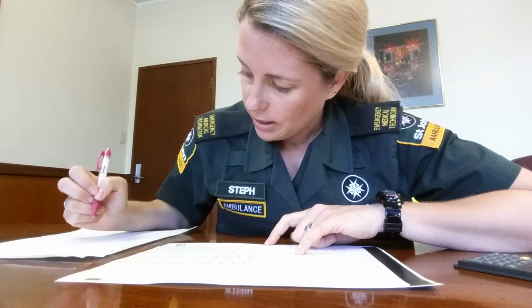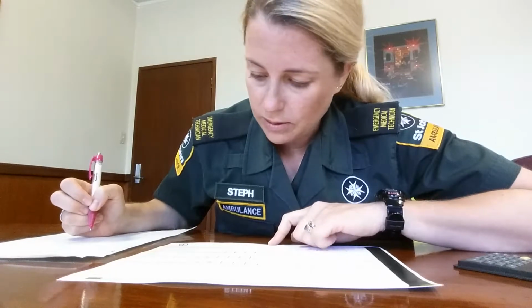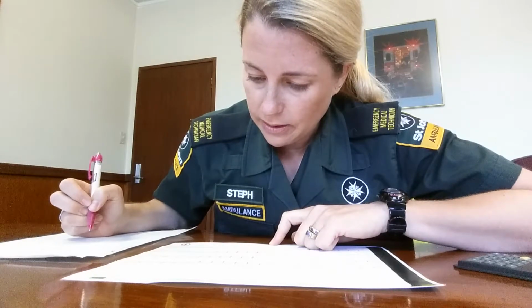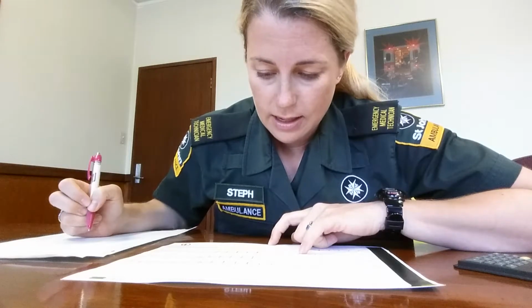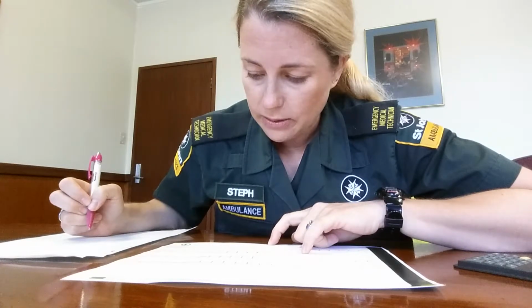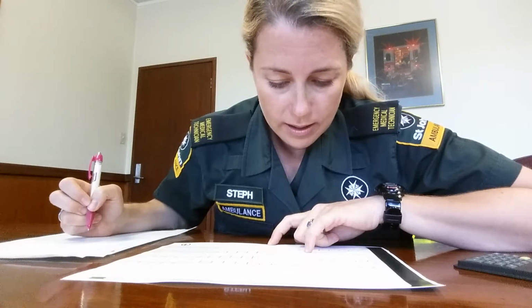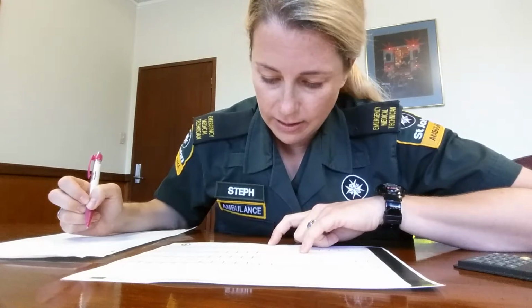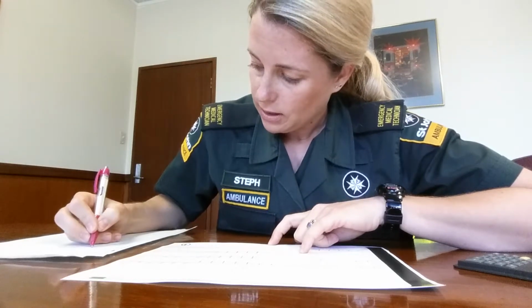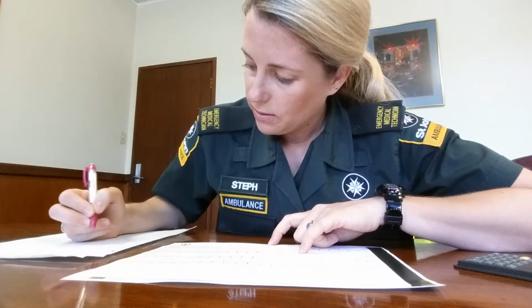And then hypertrophy, we're looking for the Sokolow-Lyon criteria, so the R waves and the S waves added need to be greater than 35, which they are not. In V1, V2, V5, and V6, needs to be greater than 12 in lead 1, 11 in AVL, and 20 in AVF, which we don't have. And we don't have a positive in V1, so we have no hypertrophy.